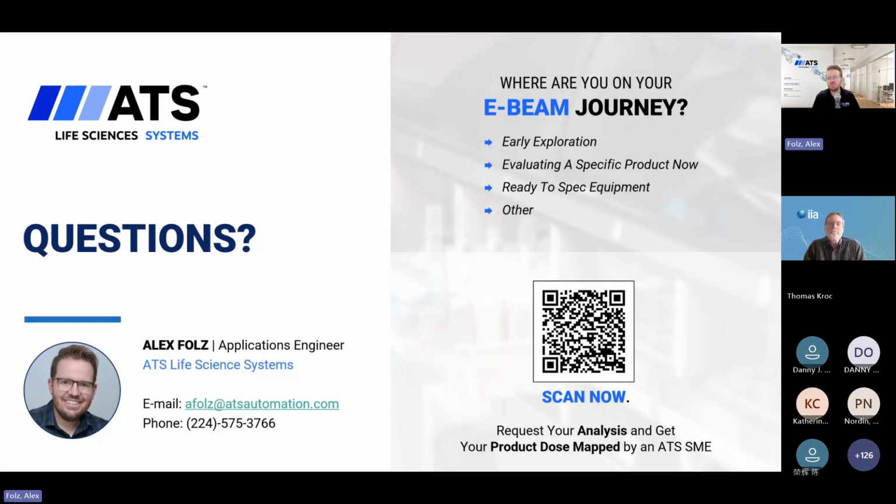Yeah, we would prefer to do much more of an experimental or real world approach at that acceptance test planning phase. So that is primarily for just verifying that our shielding design is right, because with how large that shielding is, you really have one shot to purchase it. So you really want to get it right. It does show some information on dosimetry at the part, but it's primarily used for that shielding prior to procurement and finishing that design of the shielding itself. So it's more so in that phase.